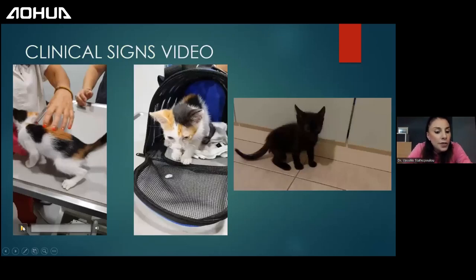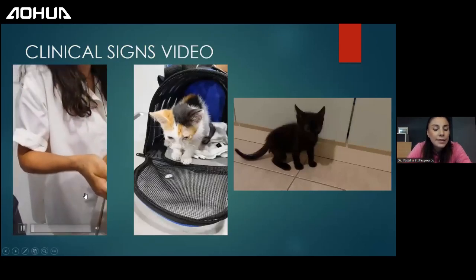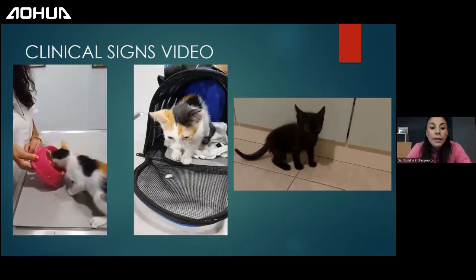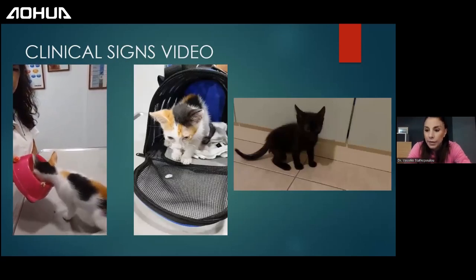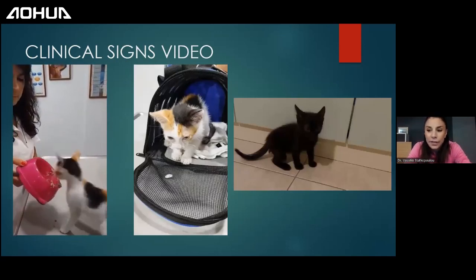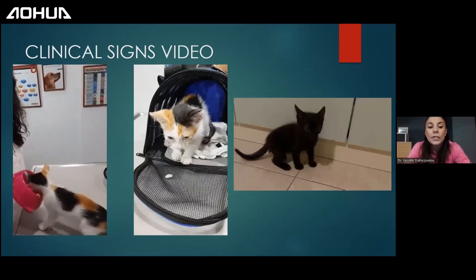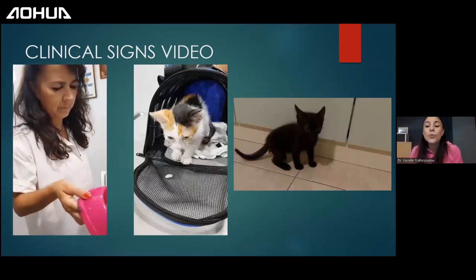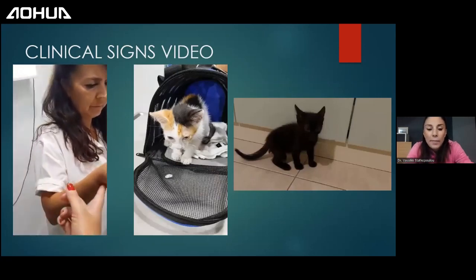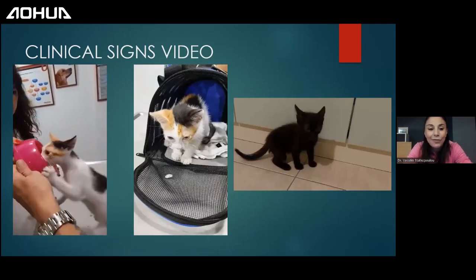Okay, let's watch this one. This is a kitten that was admitted to my practice. And this is my voice. I'm sorry, this is my assistant. And this owner kept telling me that this cat is vomiting. This small kitten is vomiting. And I didn't believe that it was vomiting. So I said, okay, let's feed the cat and see what's going on. You see that this small kitten has a ravenous appetite, is really, really hungry. I mean, it could eat actually our hands and the bowl by itself.